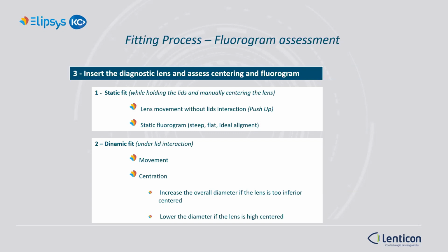After the diagnostic lens is placed into the eye, check the lens movement without lid interaction and evaluate the static fluorogram while manually centering the lens. Then observe movement and centration under lid interaction. This will give us a natural dynamic aspect of the current lens fit and behavior.